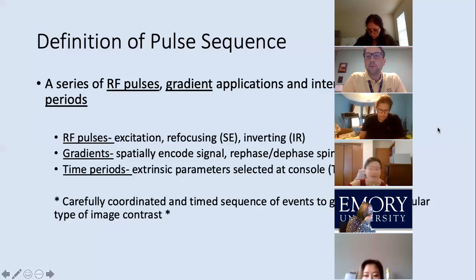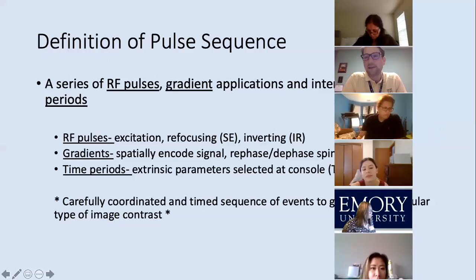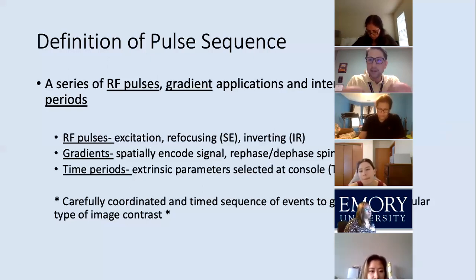So when would we want to image very fast, to the point where, let's say, like 5 seconds, 2 seconds, 3 seconds? With the heart? Heart, cardiac imaging, good, because we want to reduce the motion of that heart, so we want to image very rapidly. Abdomen imaging, where we're holding the breath. Remember, we're holding the breath for hopefully like 10 to 15 seconds. So we need to image so rapidly that we get an entire pulse sequence in that 15 to 20 seconds.